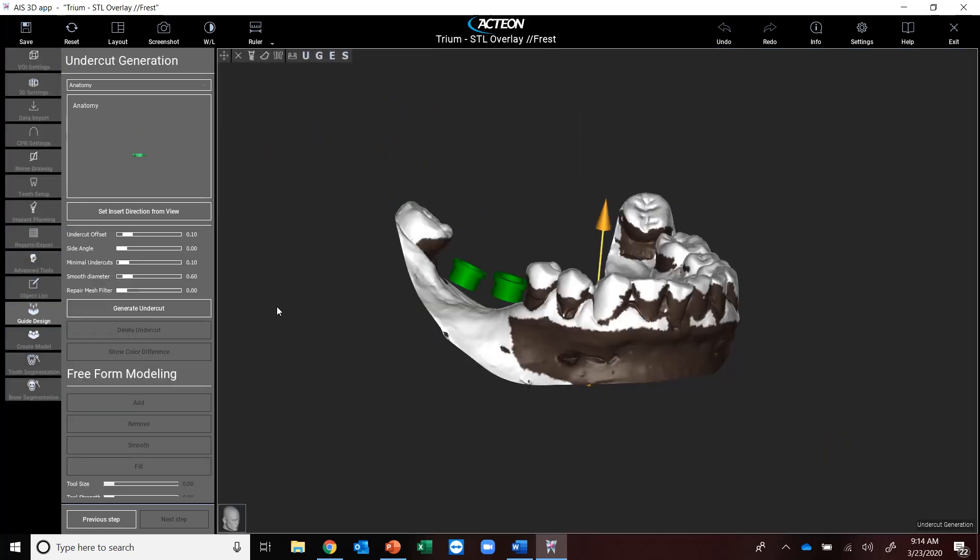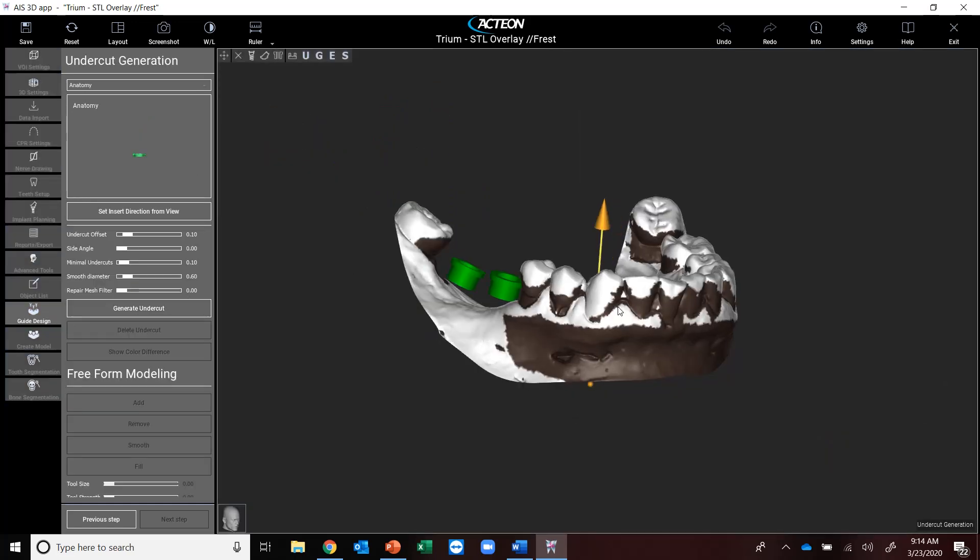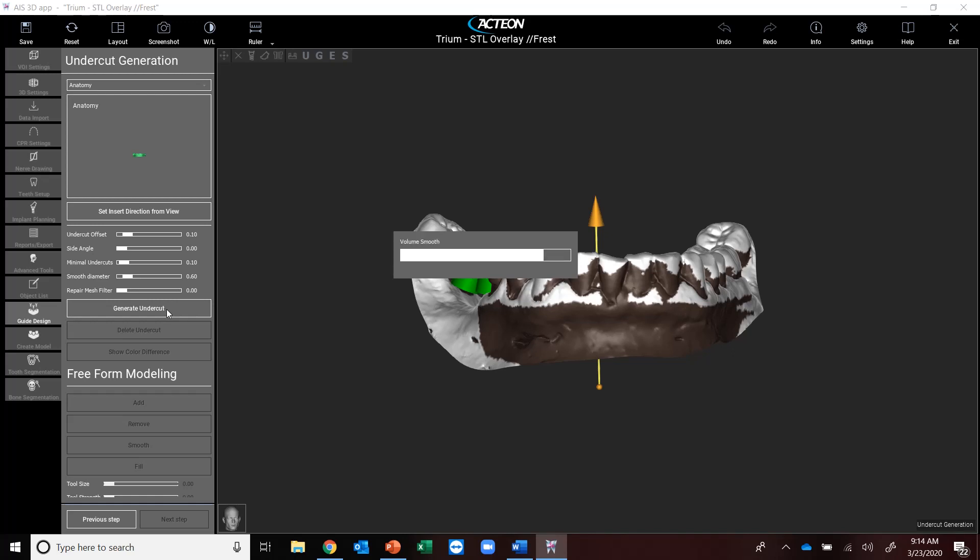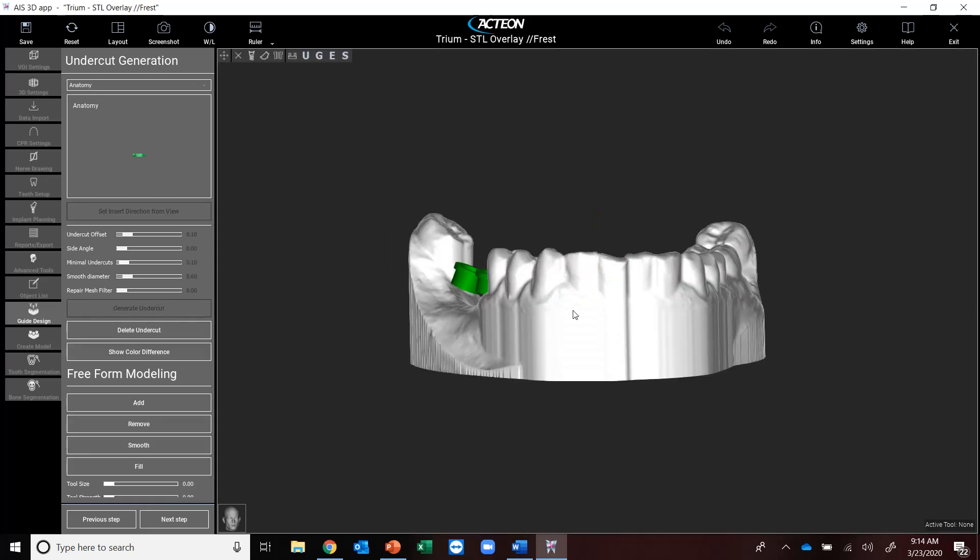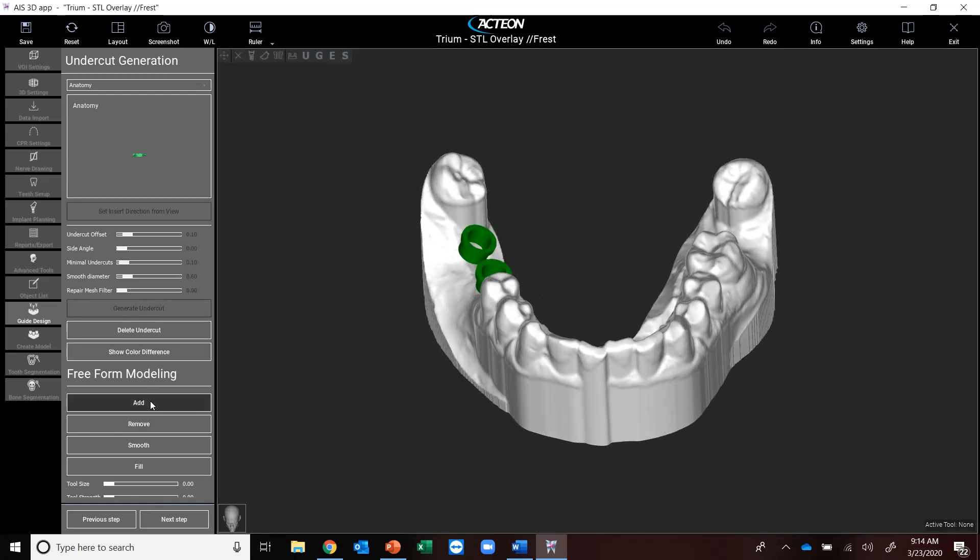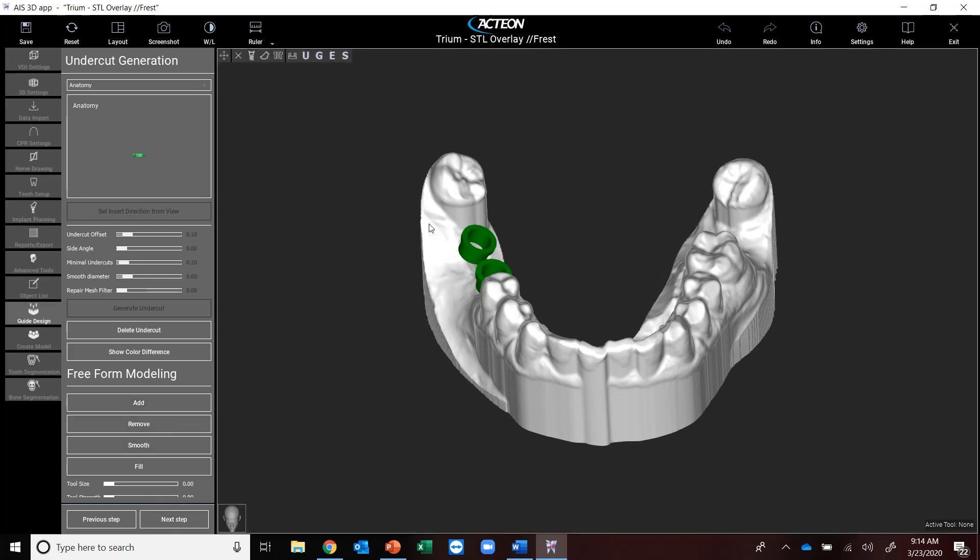Now what this is going to do here is generate an undercut. I've got some options for which way I want that undercut to be more supported with. I'm going to generate that undercut just right now, and it's going to create a model for me. I've got the ability to add, remove, smooth some areas so that guide fits pretty crisp from an overlay perspective.